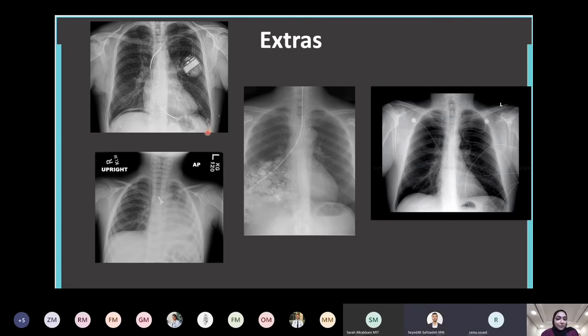Let's say this patient had a gynae laparoscopic procedure the day before. What would that be? Perforation, and that's free air. It is a small amount of air in the abdomen. So the first question I would ask before suspecting perforation: did this patient have an operation like laparoscopy? They would intentionally put some air right into the peritoneum so that they can work easily. So a small amount of air, before freaking out, especially if it's an inpatient, I'll first ask if there was a procedure. A small amount like this is regularly seen after laparoscopic procedures.